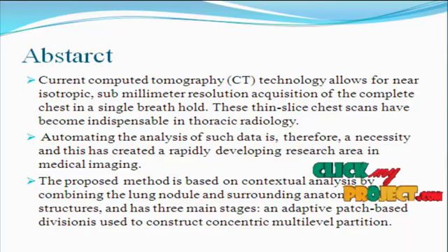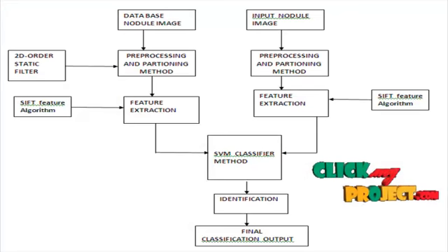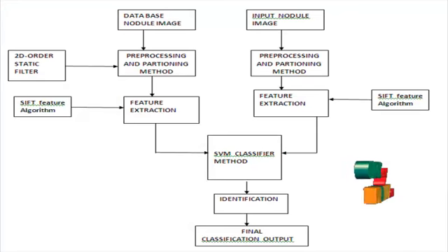Our future work: the proposed method was evaluated on the publicly available dataset and clearly demonstrates improved classification performance. Next, we will discuss the flow diagram for the project.